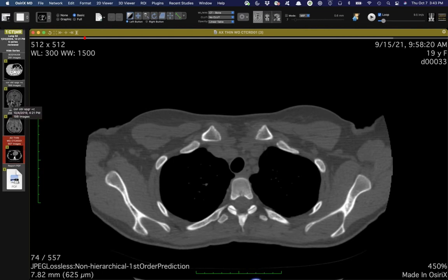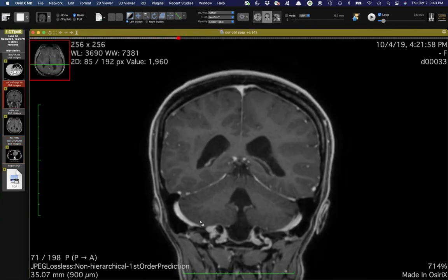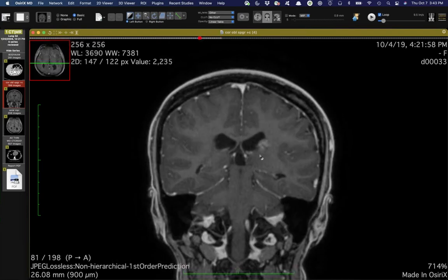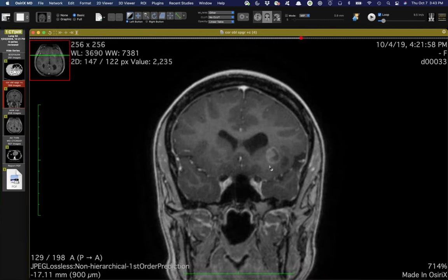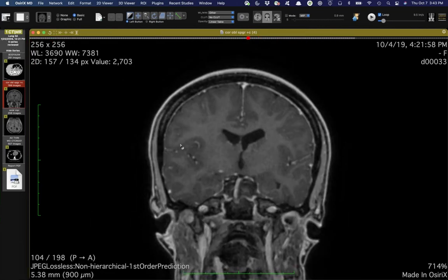So she's got 1 or 2 lung cysts. I think they're just going to watch that. I'll show you her brain, which is pretty impressive. You can see she's got a lot of subependymal tumors, and she has some cortical tubers as well. And interestingly, she does not have a family history.